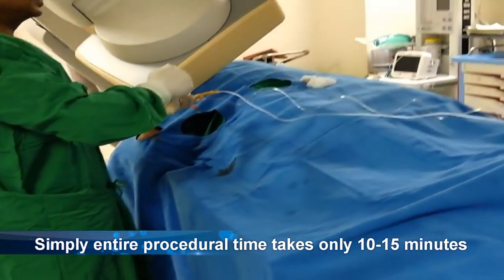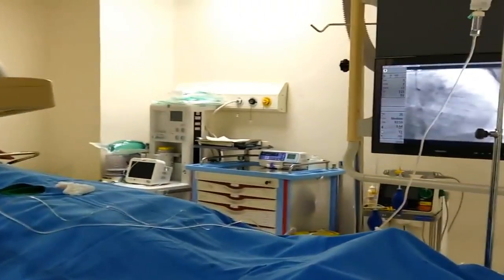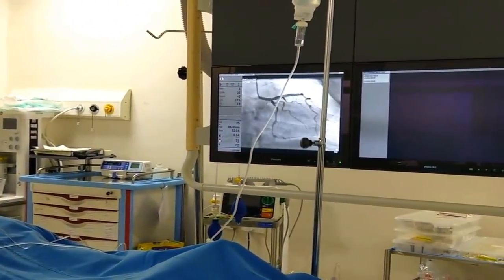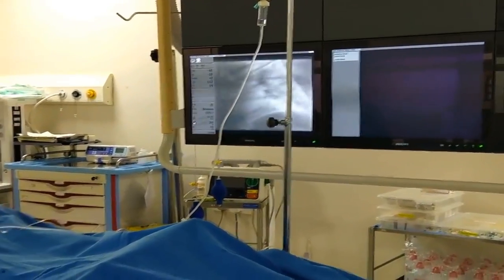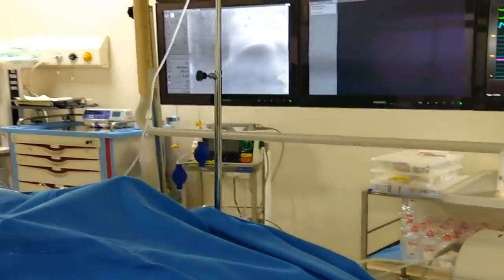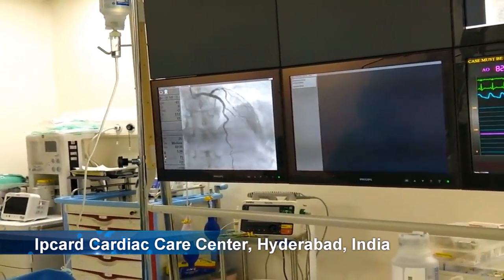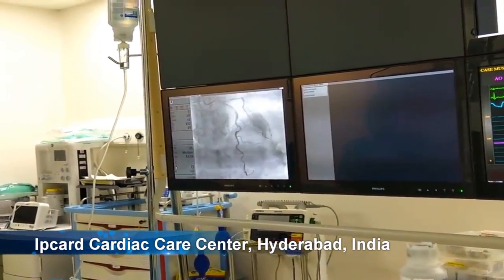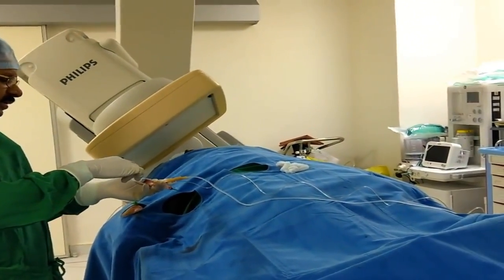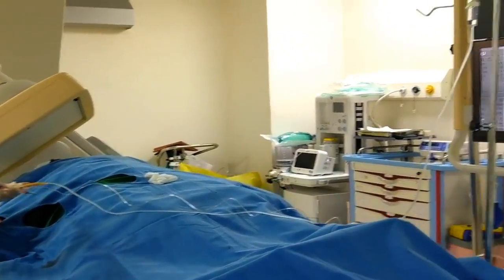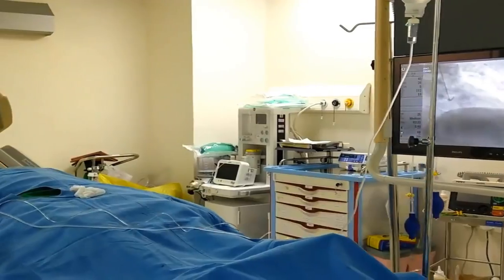During the procedure, we advise the patient not to move their head, legs, or arms — they can lie down comfortably and there won't be any discomfort. The left coronary artery is being evaluated in different views, and the X-ray tube is moving at different angles.